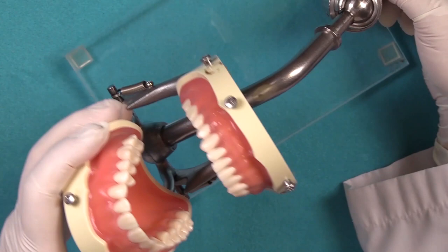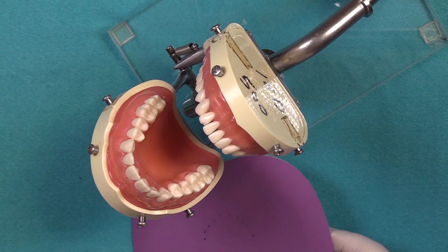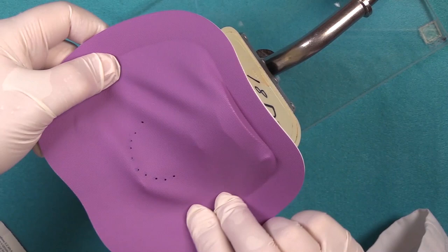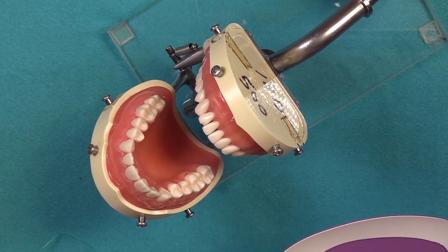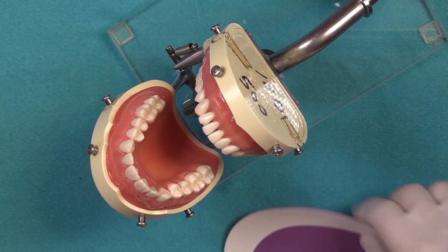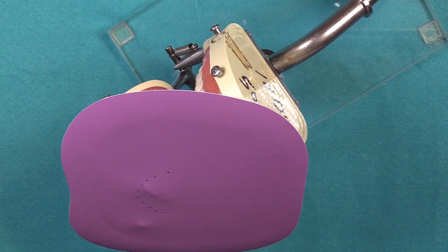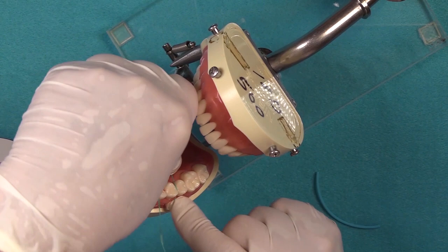Now it is helpful to have someone to help you with this procedure. I'm going to attempt to do this by myself so bear with me. I might fumble just a little but I think I could manage. We're going to use a little water-soluble lubricant. Incidentally the dam can be placed either in this manner or this manner. It really doesn't matter. It's more aesthetically pleasing in this manner. We're going to put a little water-soluble jelly on the tissue side of the dam and we're going to anchor one side at a time. Let me check my contact here. Pretty decent contact. Might be a little bit of a challenge but let's see.